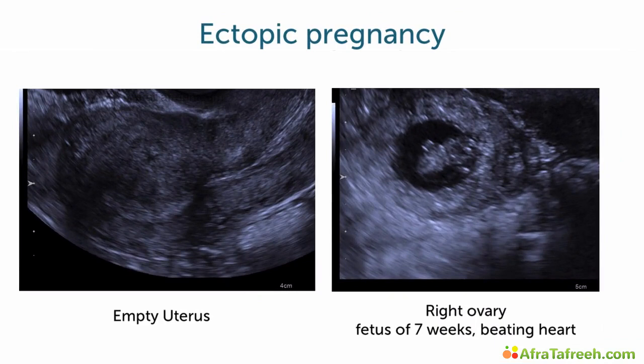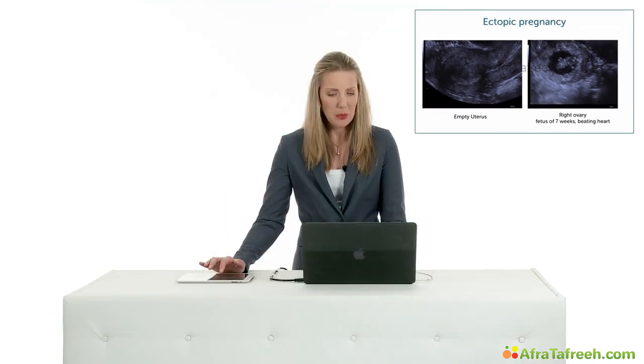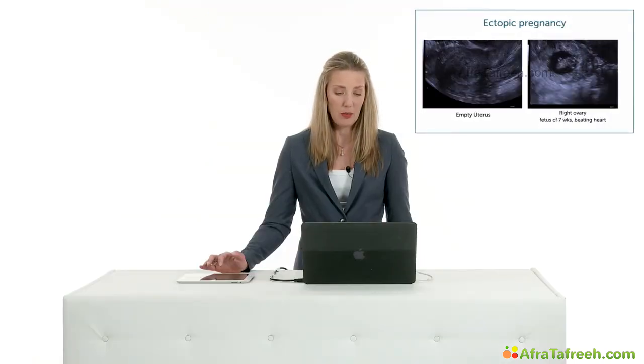We see the uterus here on the left side. And it looks like the endometrium is closed and that there are no signs of any pregnancy. But that was weird, because this woman who came in had her last menstrual period around 9 to 10 weeks ago. She did a pregnancy test, which was positive. So then you go on and look further in the abdomen, because it's not possible that you have a positive pregnancy test and it's not showing any pregnancy.